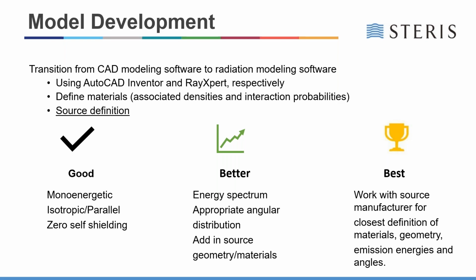If you establish a relationship with the source manufacturer, however, which would be based on a mutual benefit between shared information, it allows the simulation process to capture variations of the source. With the better approach, you could expect to be able to match results, but it might not be repeatable.